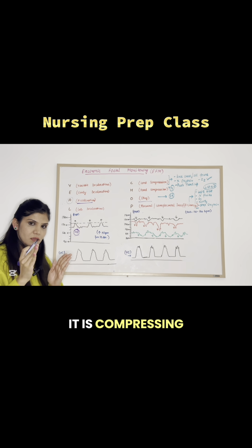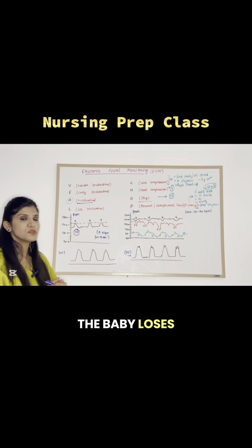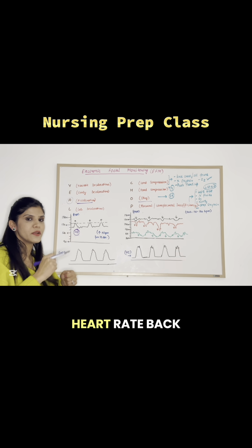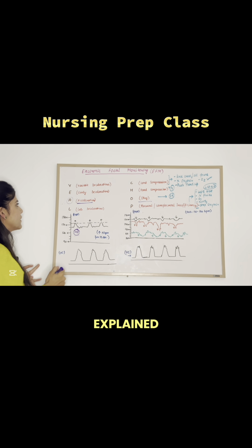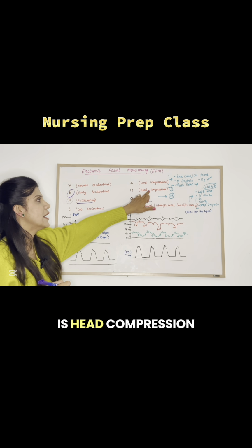It is compressing the head of the baby along with the blood vessels, due to which the baby loses blood supply momentarily before resuming his heart rate back to normal when the blood supply came back again. So this is as easy as it could be explained. So we are done with early decels too. And the reason for early decels is head compression.